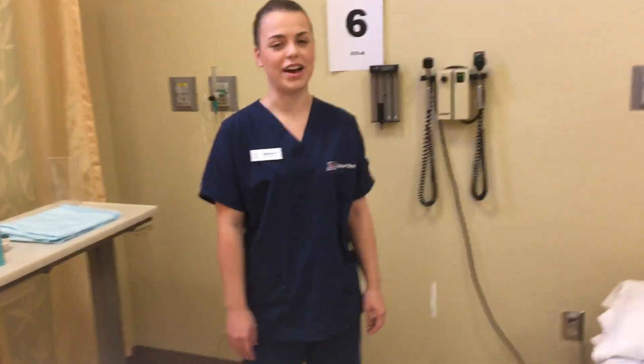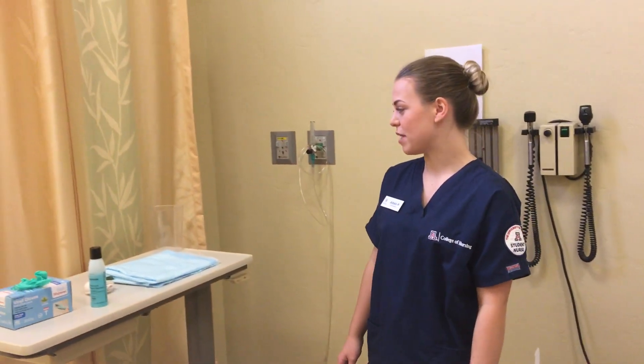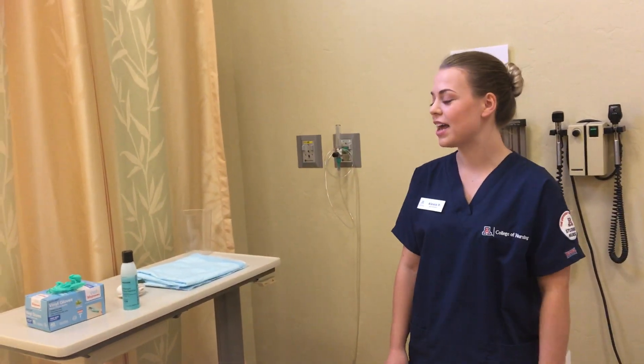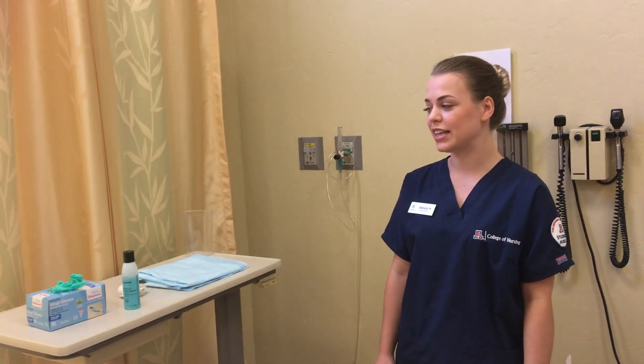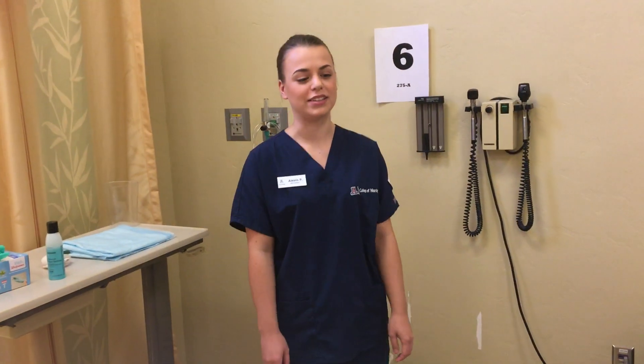Giving you a 360 view of my workspace shows that I have pulled the curtains fully to ensure patient privacy, and that I also have adequate lighting for the procedure. Over here I have my supplies: a graduated cylinder, chucks pad, leg strap, hand sanitizer, clean gloves, and on this table I have my Foley catheter kit where I will be setting up my sterile field.